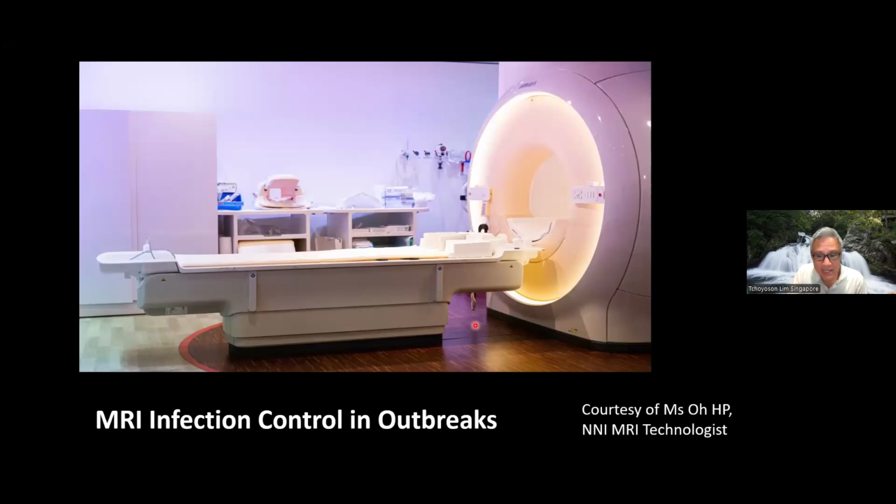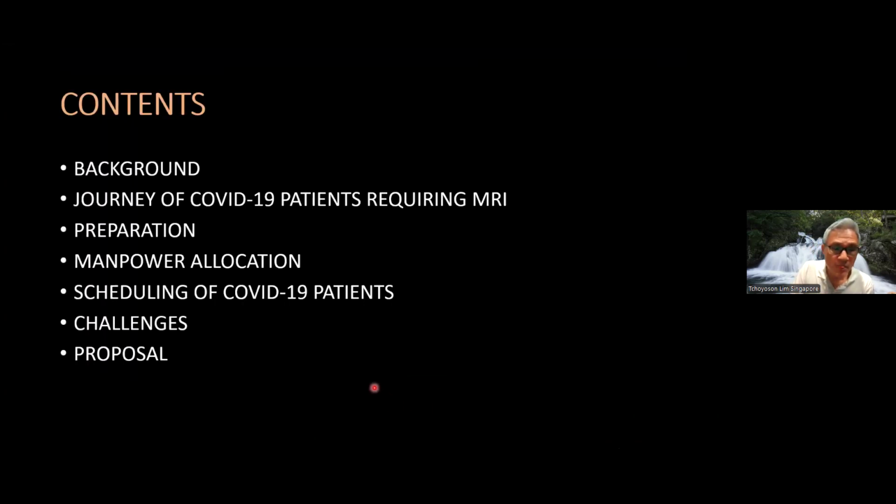So the following slides are courtesy of Ms. O, our Chief NNI MRI technologist. In brief, it describes some of the MRI infection control, specifically in COVID-19.